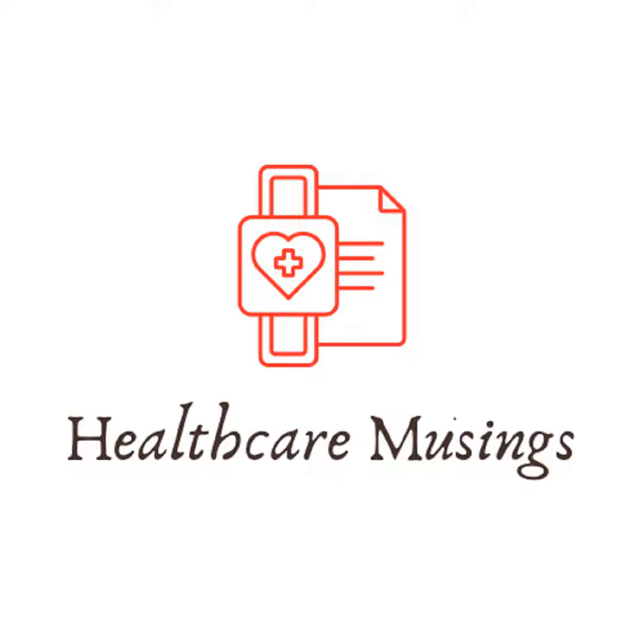Okay, now if the patient is breathing 20 times a minute, for example, they will get 15 breaths at 450 cc's. The remaining 5 will be at a pressure support of 10. Okay? Now, if a pressure support of 10 is not enough pressure to generate a tidal volume of 450, you're going to have breaths that are inadequate. Right? So if a pressure support of 10 only gives the patient a tidal volume of 300, so now they have 15 breaths at 450, and then they have the remaining breaths at only 300.